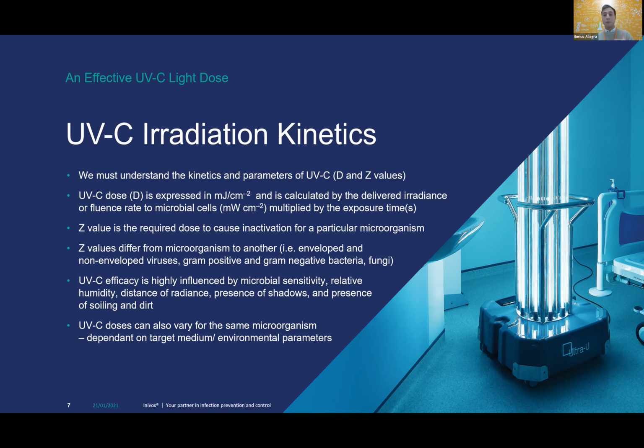So obviously, it's the irradiance versus how long you're exposing a certain microorganism to your UVC equipment. And another parameter we're going to introduce now is called the Z value. The Z value refers specifically to the required dose to inactivate any specific organism. Therefore, Z values are not unique. There cannot be such a thing as one Z value per equipment, for example, per system.